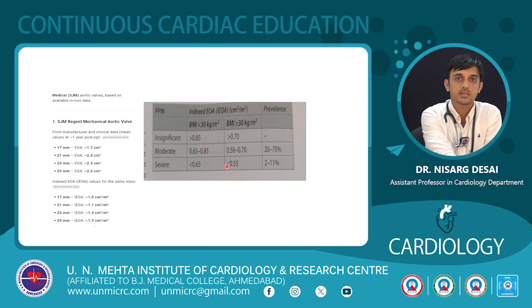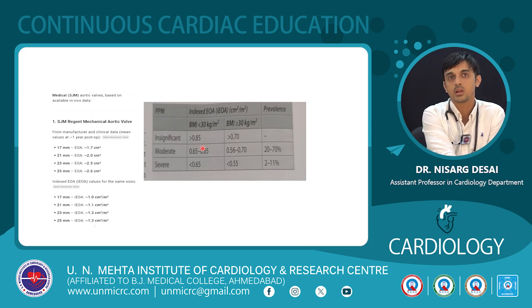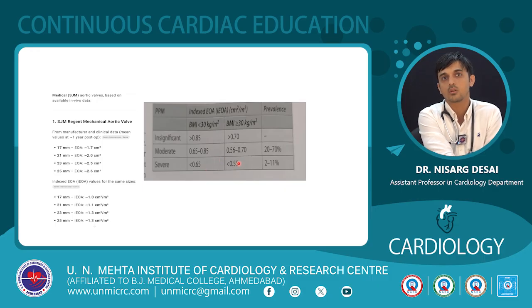As the body surface area increases, the cutoff is slightly lower, less than 0.55 to be labeled as PPM for an obese patient versus 0.65 for a patient having BMI less than 30. So it is purely a mathematical way to represent that if the patient is more obese, the cutoff has to be further lowered down to 0.55.